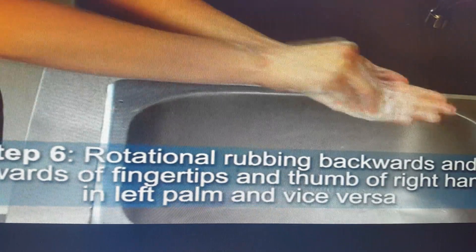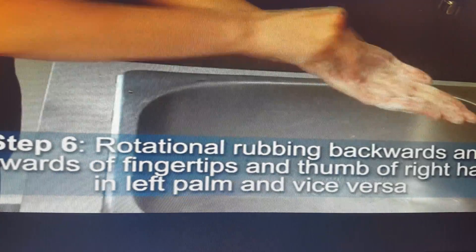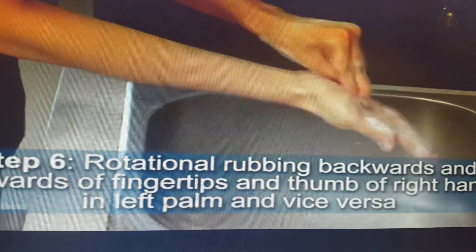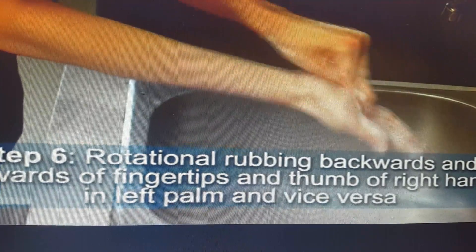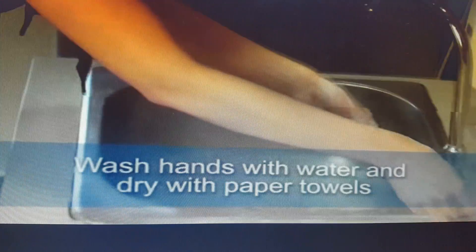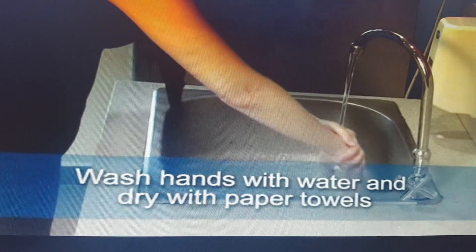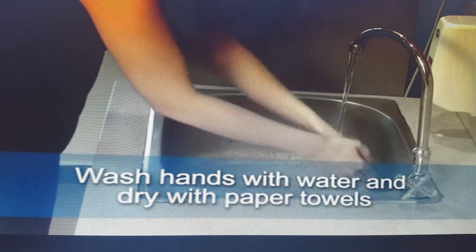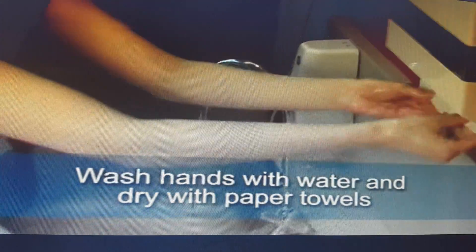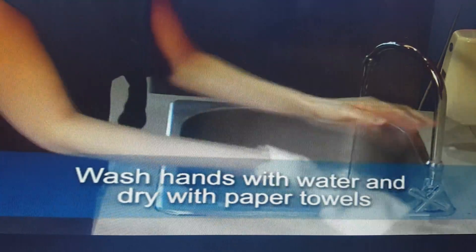The final step — step six — is rotational rubbing backwards with a circular motion. You also have to cut your nails. After completing the six steps of hand washing, wash your hands with water. Take care that you do not touch the sink. Then take tissue to dry your hands and close the tap with the tissue.